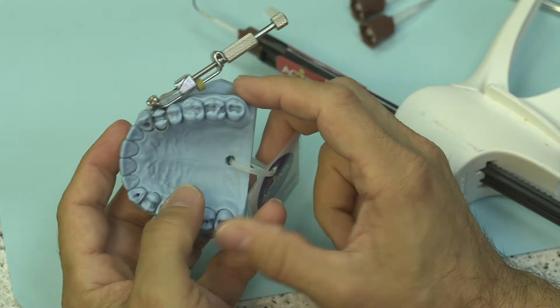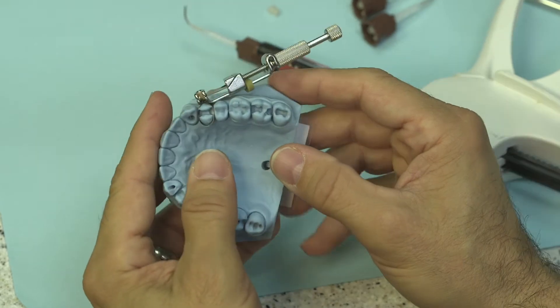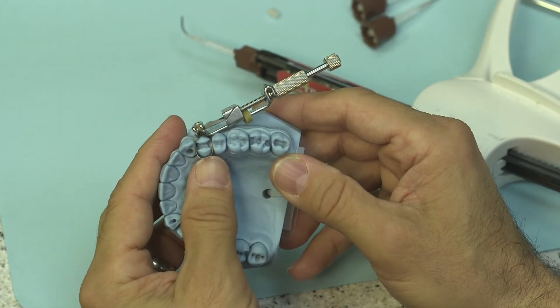Hey, we're going to do a class 2 restoration now. Now I'm using a traditional Toffelmeyer band and retainer.